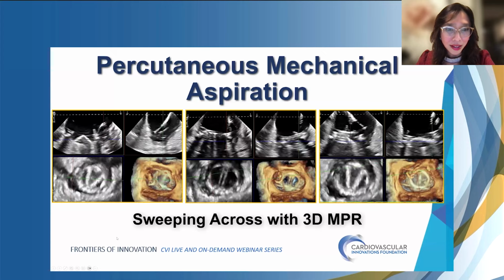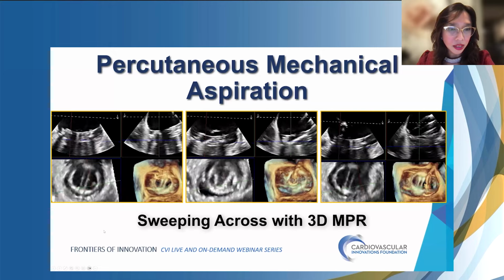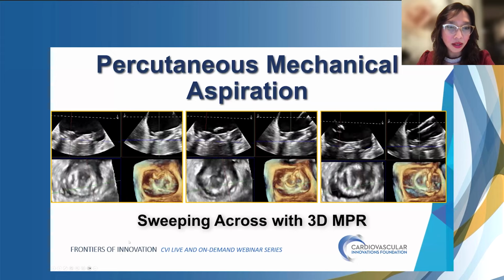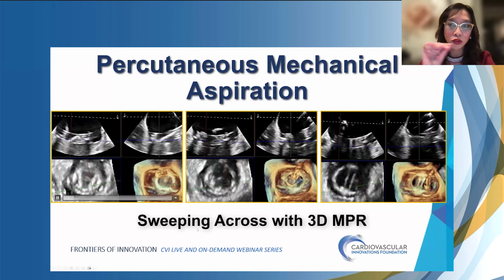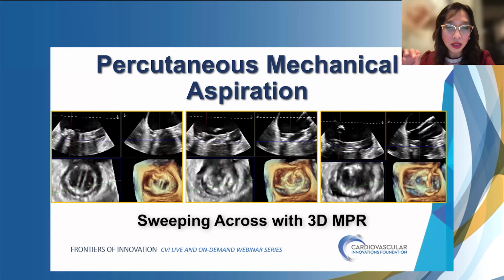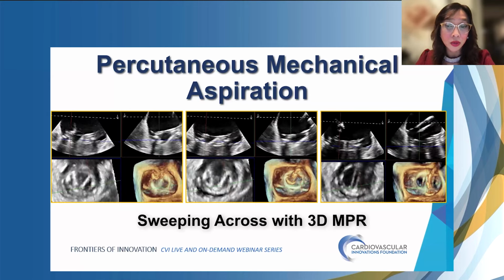And then next slide, and Paul was like, is there any more? And so this is when I said, yes, if you see on the left-hand side, there's actually a flicking at 4 o'clock position remaining there. So I brought my crosshairs to 4 o'clock where he then navigated the angiovac system to 4 o'clock. You can see in the middle image, he's navigating across down to 4 o'clock. And on the right-hand side, you can see that's where he is.